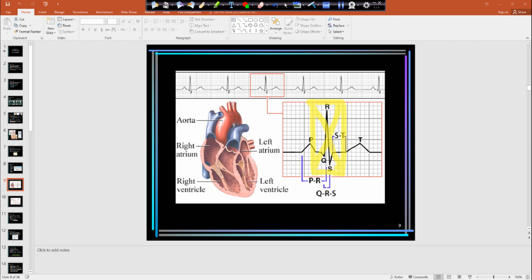on our particular image. Because those phase shifts are not going to go into the correct area of K-space, and then once they go through the fast Fourier transformation, it will look like that streaking across the patient. So remember that aortic coarctation image that I had last time, where the patient was holding their breath, but we could not compensate for that heart movement, and it created that artifact that went across the image. So if we image during this time, that's what would happen.